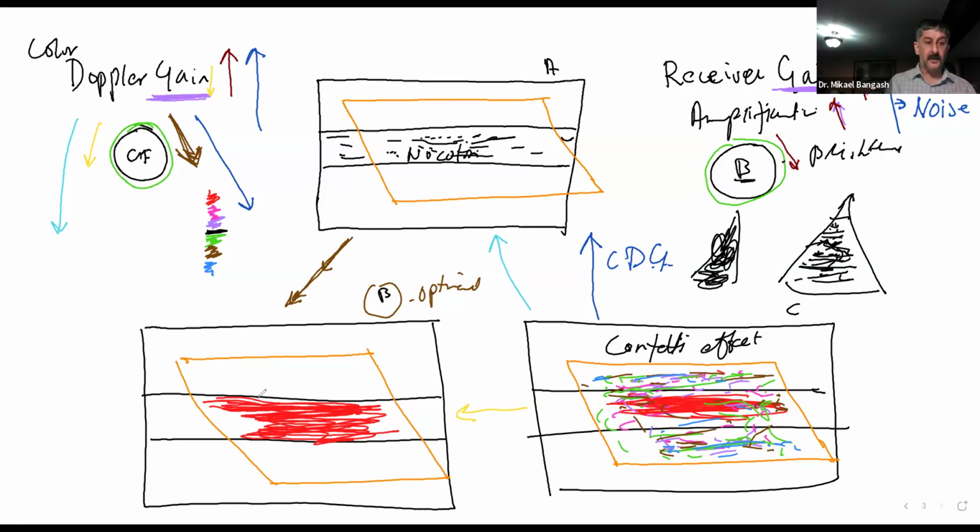Ideally, you should just stop once the blood vessel is fully filled up. If you go beyond this, what you will start seeing is little small sparks here and there. And if you keep on, you may get this colorful display.